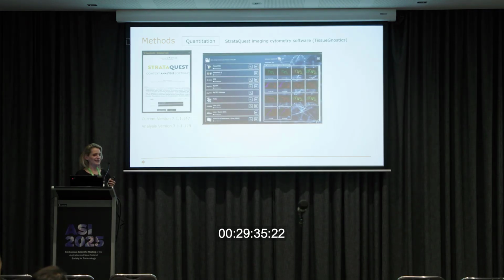One other thing to note is what I'm doing today, it looks quite complex, and what I'm doing is actually designing my own apps. But when we first got this software, we basically gave these guys our stains and said, these are our markers, these are our questions, this is what we want to do. And they designed the profile for us with this easy user interface that we could then directly do the analysis ourselves. And so this is kind of the opening screen here with the apps and stuff that they designed.